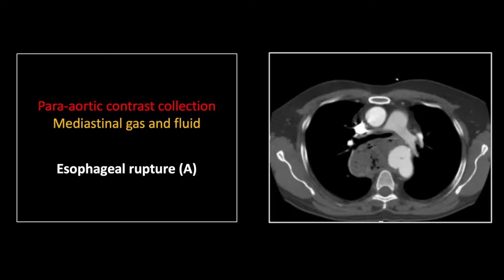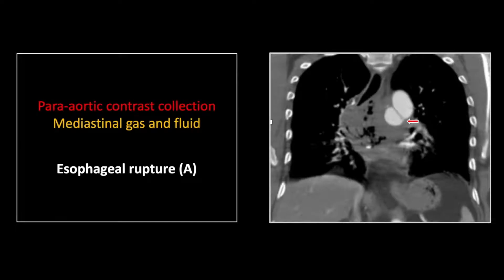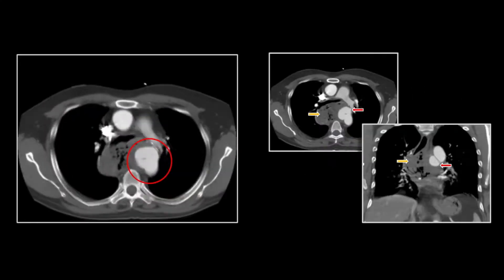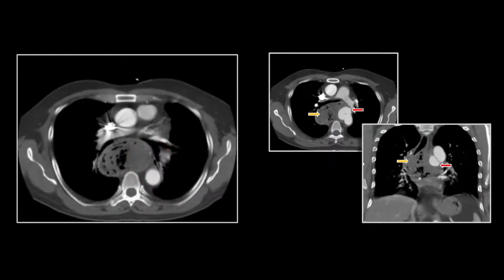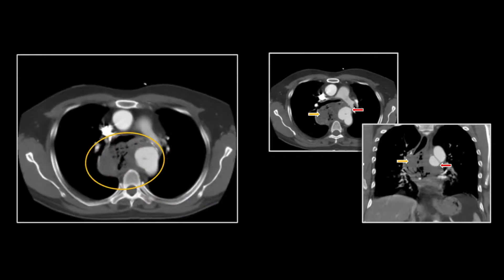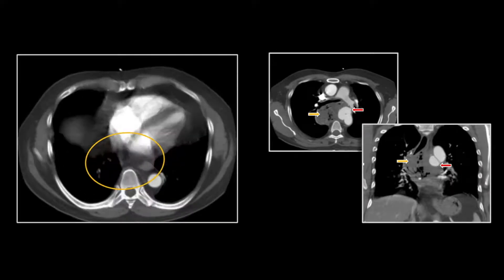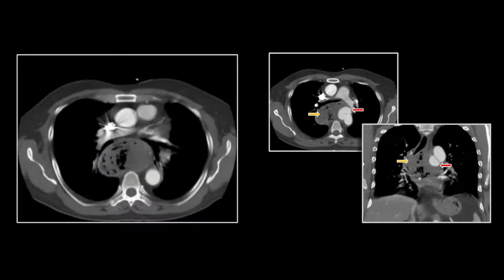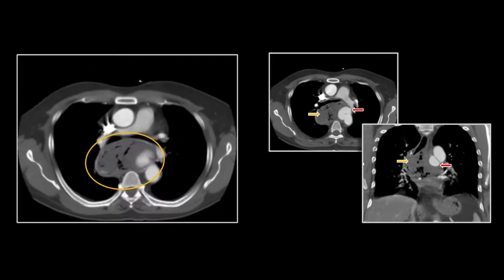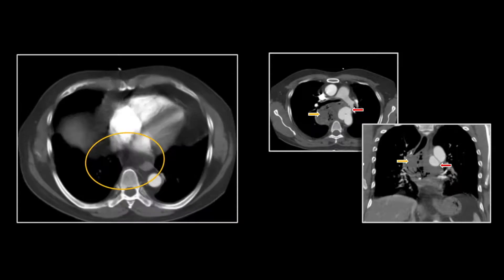So in traumatic esophageal ruptures, you will not always see extensive pneumomediastinum. The coronal helps you appreciate that — there is the pseudoaneurysm and the well-circumscribed collection of gas and fluid. You can see the esophagus superiorly entering it, then disappearing and exiting at the bottom.